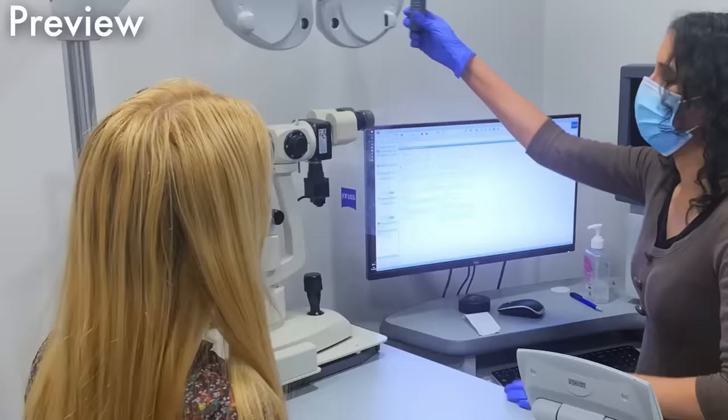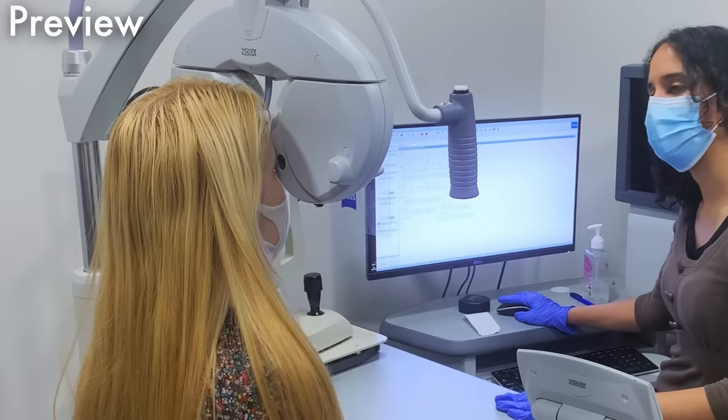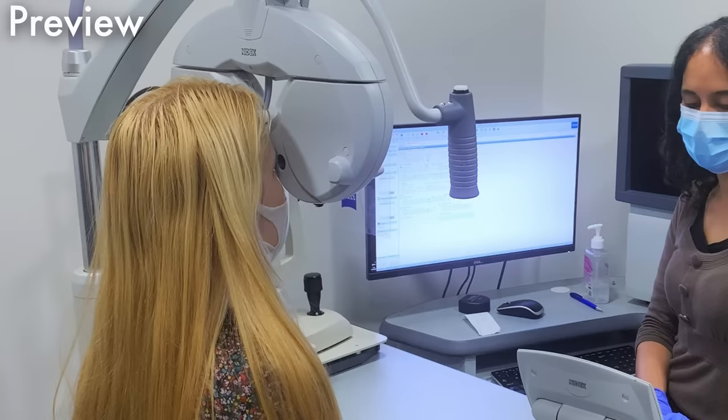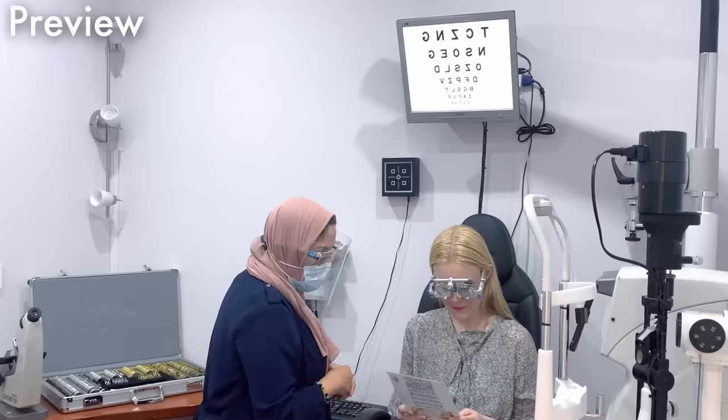So, if I can ask you to look through these for me, like a pair of binoculars. So we'll do your right eye first. So I've made your left eye a little bit blurry, so it might feel a bit strange, but if you can try to keep both eyes open for me. So if you look back over to the middle line, is that middle line clearer with number one now, or clearer with number two? The number one. Okay, good. And then between number three now, and number four. Number three.